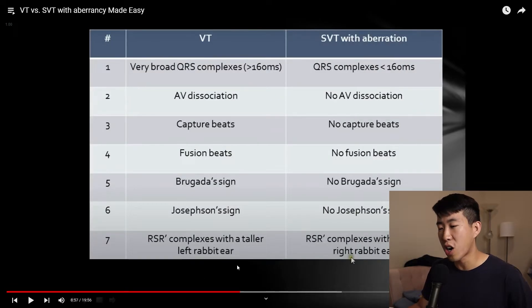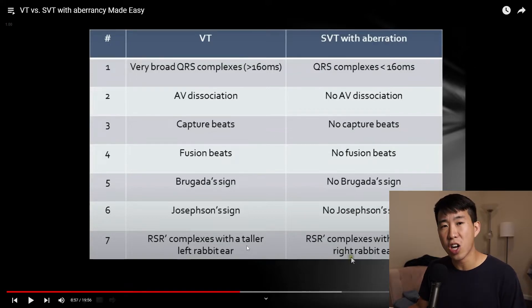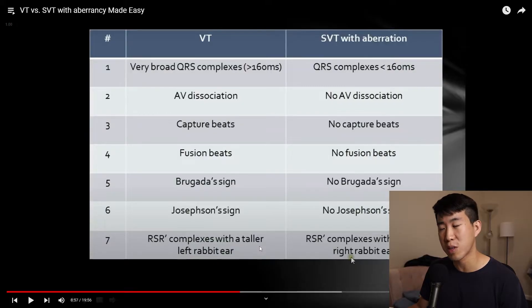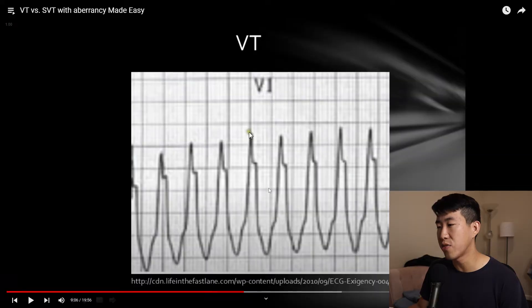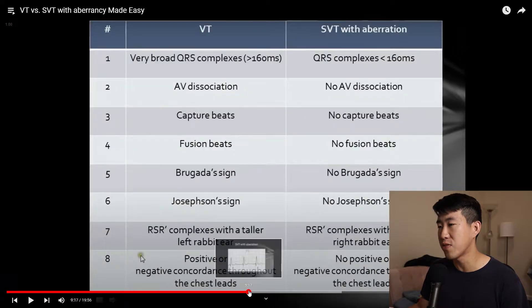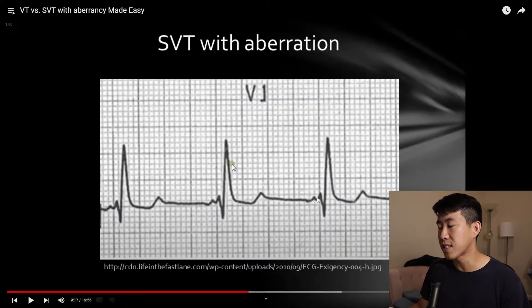RSR prime complexes in VT typically have a taller left rabbit ear, whereas RSR prime complexes in SVT with aberrancy usually have a taller right rabbit ear. So in VT, you have this tall left rabbit ear with a huge S wave coming down, whereas with SVT with aberrancy, you get an RSR prime with a taller right rabbit ear.